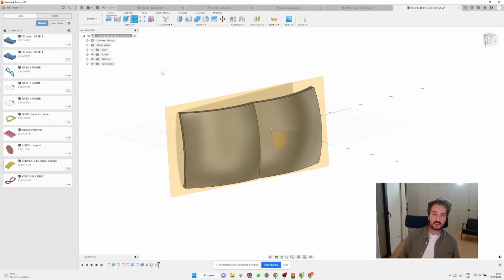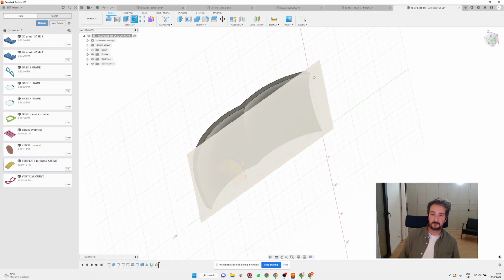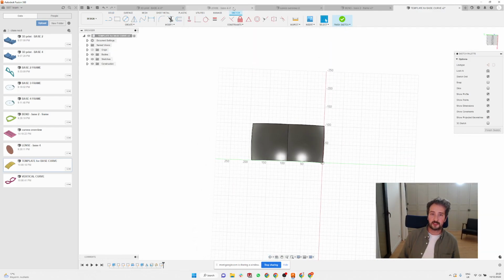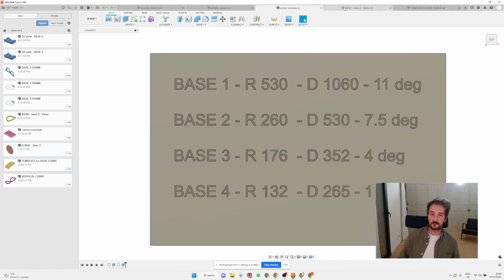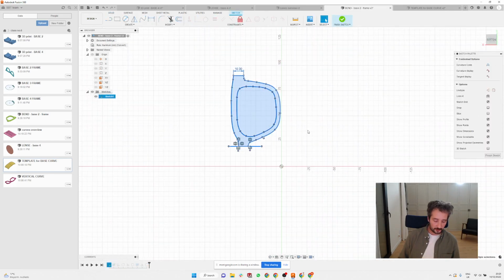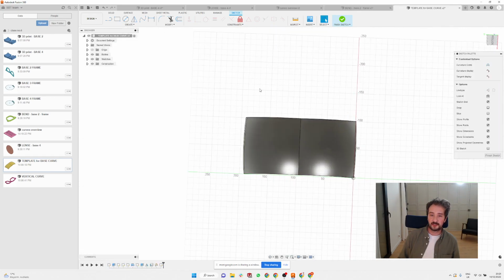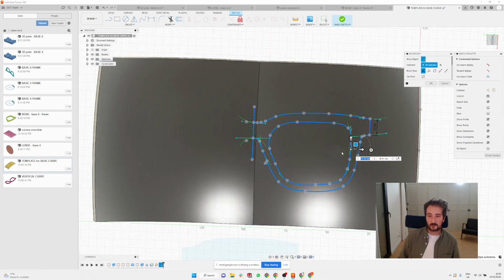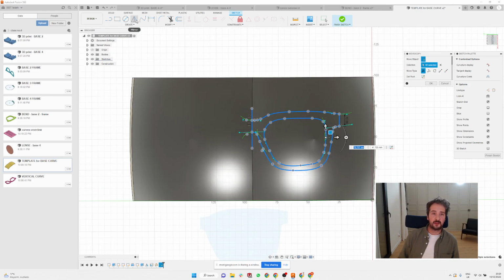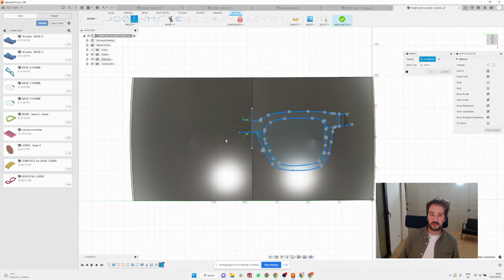So I'm gonna create a sketch here on this orange plane, and I'm gonna put in a design of my frame. I'm gonna take this original sketch, select it all, copy it, and insert it here. I'm just gonna rotate it by 90 degrees and put it approximately in the center. And now I can mirror the design left and right across the center line.